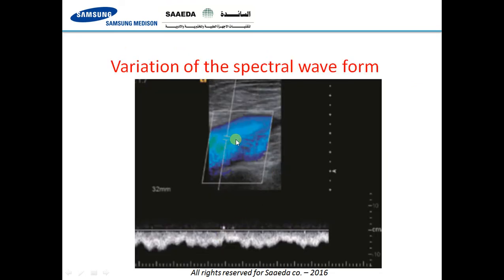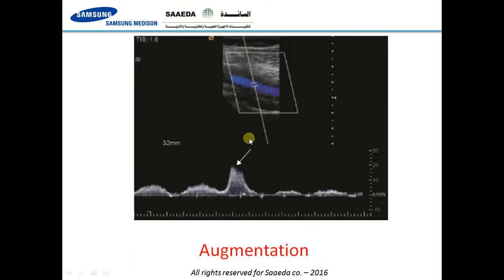There is also variation of the spectral waveform — the normal phasicity of venous blood flow shows a changing flow pattern. Here you can see augmentation: when you compress the calf, there is a sudden increase in the velocity of blood flow in the vein. This is a normal vein with normal augmentation.